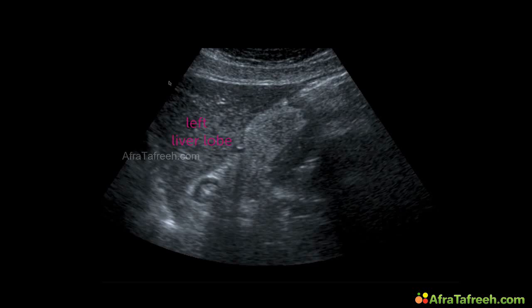So again, liver parenchyma. Do you see this tiny structure over here? Yes, it's something special. The cardia of the stomach. So we have fundus over here and the cardia. But now we deal with the liver parenchyma. We concentrate on the left liver lobe again and take the next picture, please.